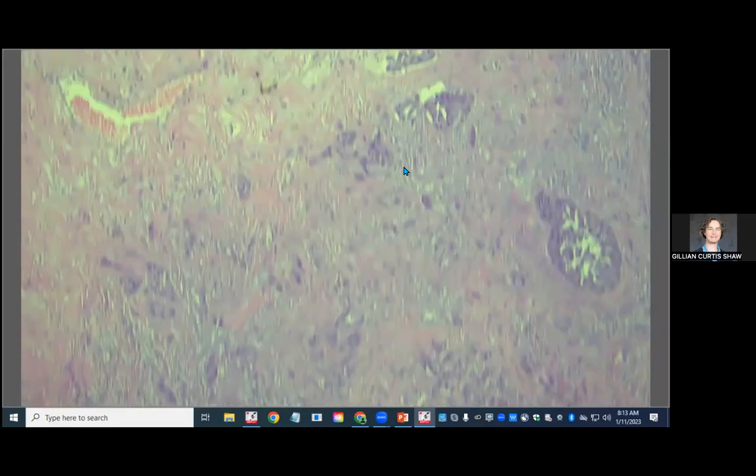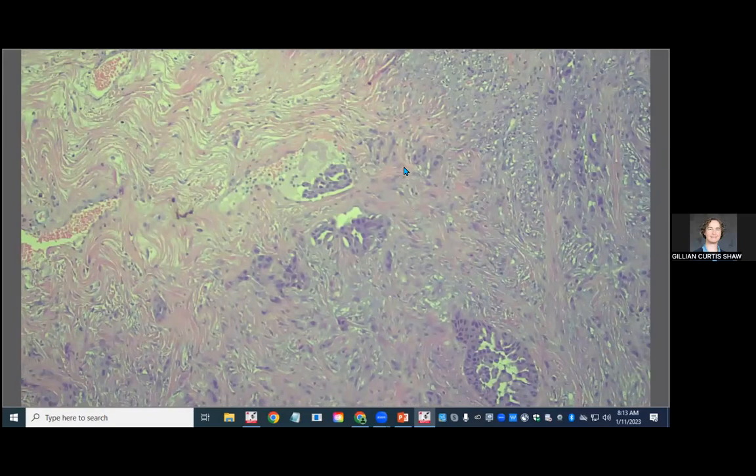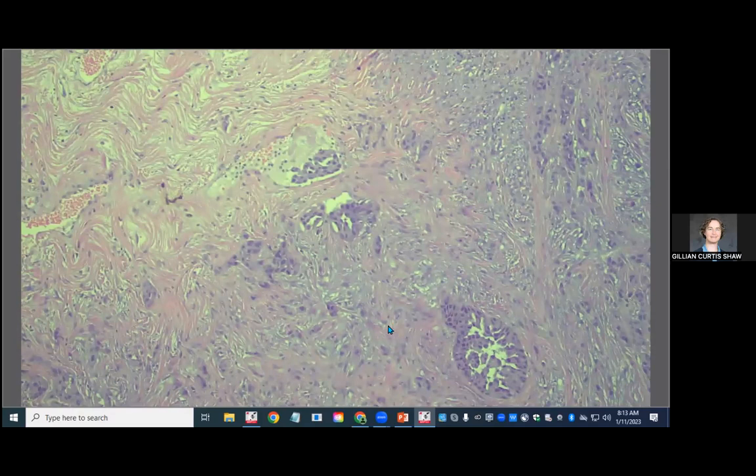Okay, so this is actually a good spot to stop. We're going to stop here for a minute. So we have kind of two populations of cells here. We've got these guys who are more epithelial looking, kind of cuboidal. And then we've got all of this, which is more spindly. So all of this is probably fibrous connective tissue and a scirrus or desmoplastic response. And then these guys are neoplastic epithelial cells. So this is a carcinoma.